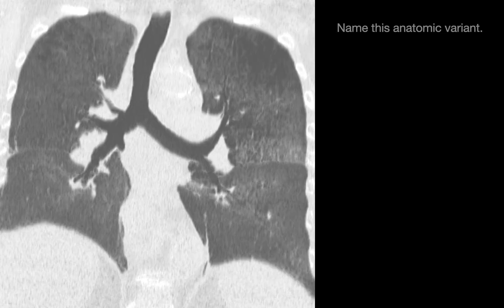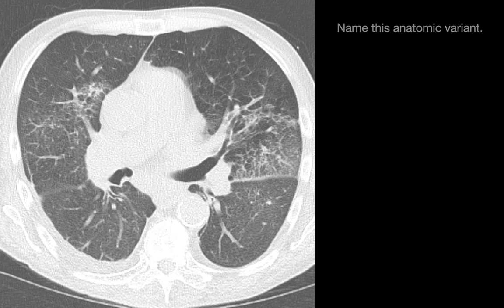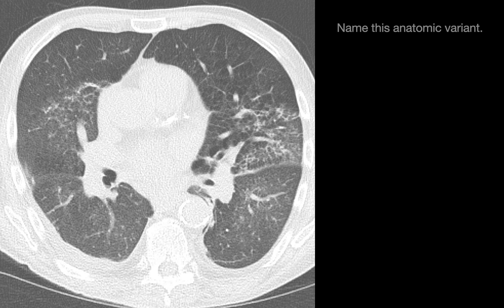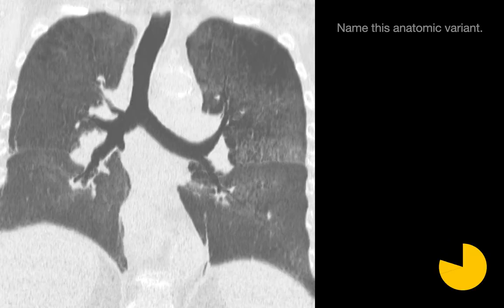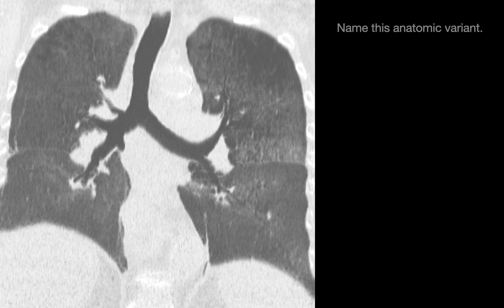Name this anatomic variant. The anatomic variant here is circled in magenta. We have a blind-ending, short bronchus arising from the inferior surface of the bronchus intermedius. This is an accessory cardiac bronchus.